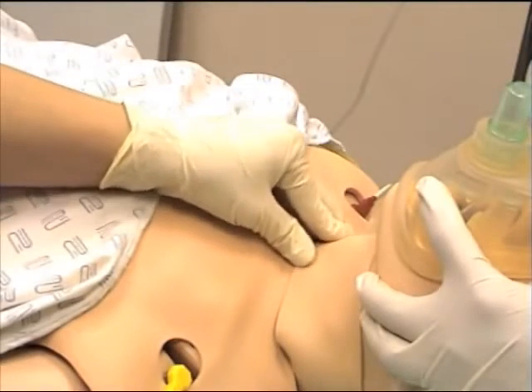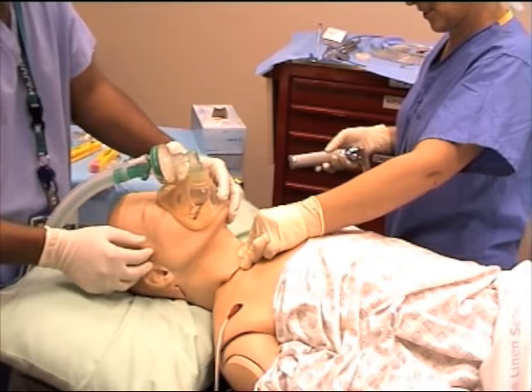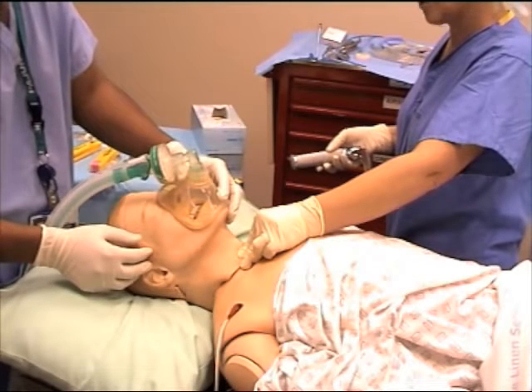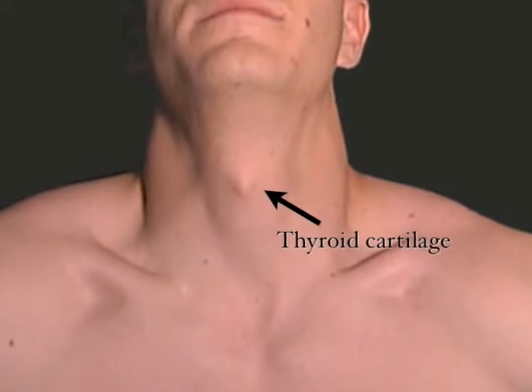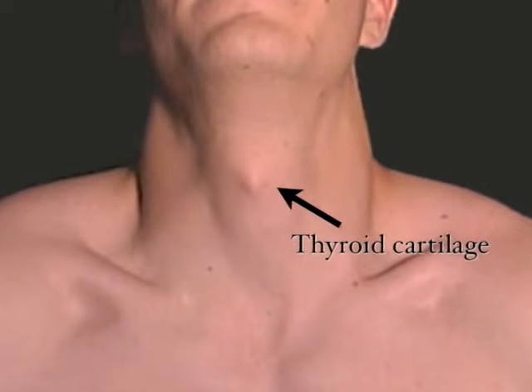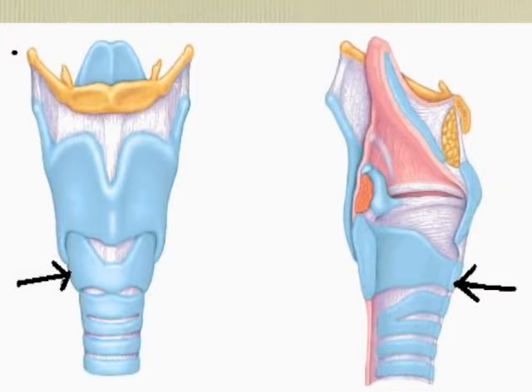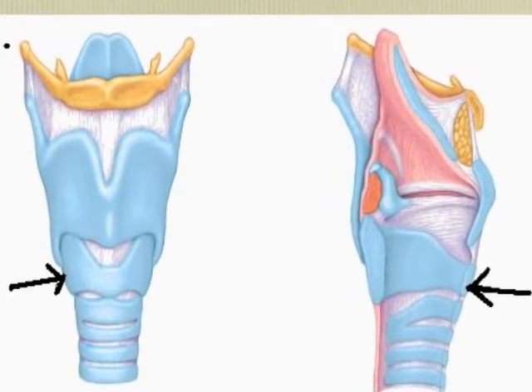Cricoid pressure should be applied by trained and competent staff. Too much or too little pressure on the cricoid can lead to airway complications at induction of anesthesia and potentially compromise patient safety. Cricoid cartilage can be identified on a patient by palpating the thyroid cartilage, otherwise called Adam's apple, and following down to feel the rigid cricoid cartilage. These two cartilages are connected by the cricothyroid ligament.